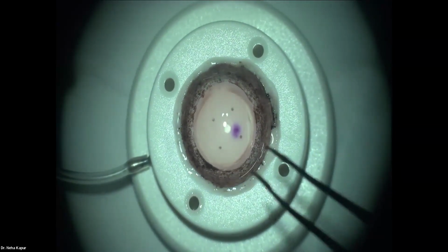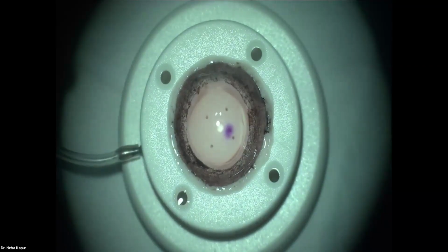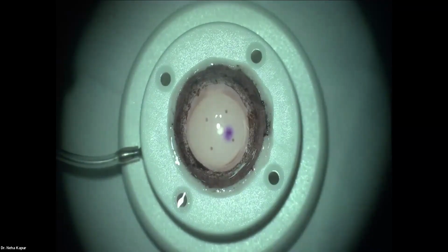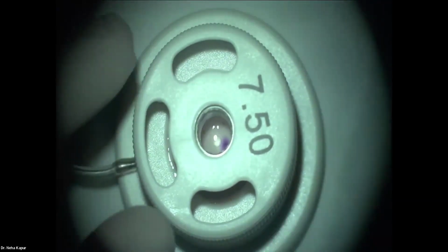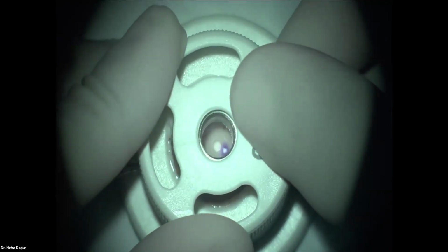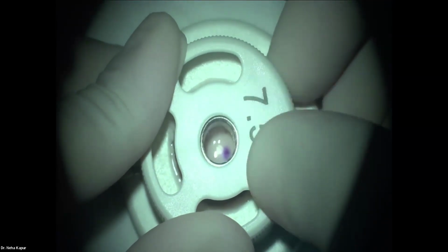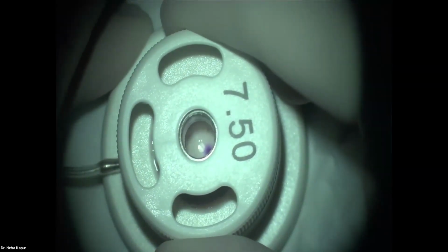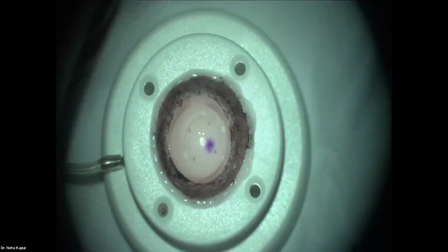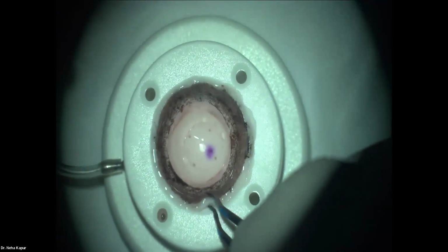Okay, so now the tissue is well centered. You see there is a little smudgy mark, and it's usually good to have your own mark on this. Ensure the size that you have to use is the same as what you have decided. Do a trephination. And then we pick it back up. Get the periphery of the tissue out.